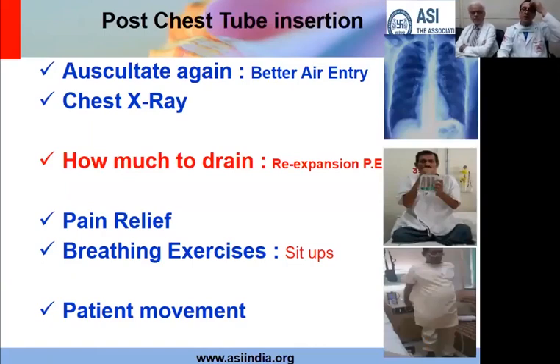Now, after you have inserted the chest tube and settled all the things, the first thing you should do is to auscultate the patient's chest. You have auscultated before insertion, you should auscultate immediately after insertion, and you would find that the air entry now definitely should be better because the air or fluid would have been drained. It's always important to do a chest x-ray as soon as the patient is stable, to document that whatever reason I put it for, whether it was fluid or blood or air, it has now drained.